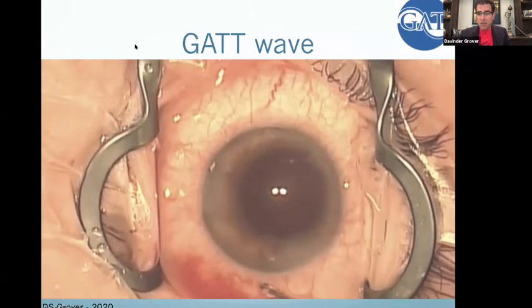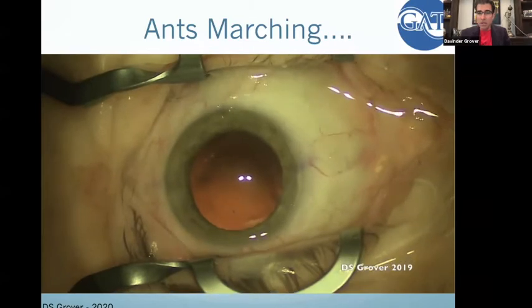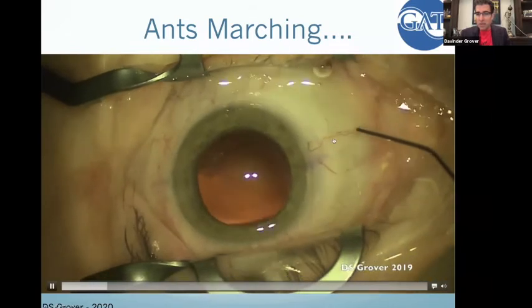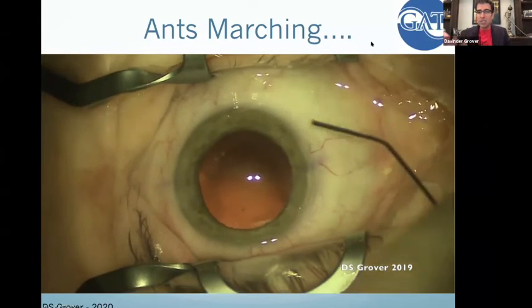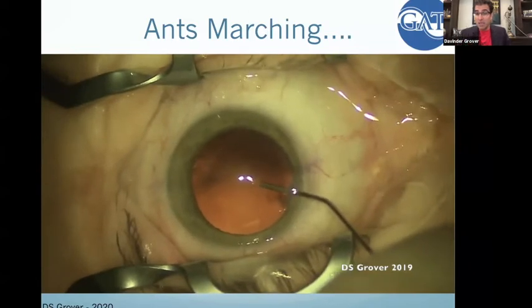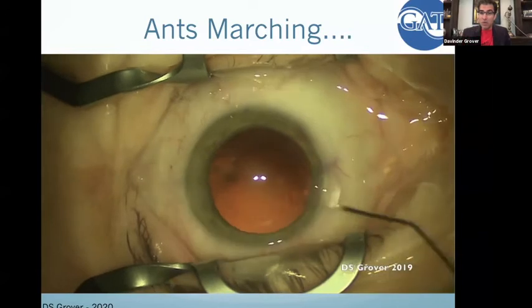And what we did was, and this is just another thing. This is after a dual blade, a hook dual blade goniotomy. You see, just as I'm just a phaco dual blade, look at the pattern. This is almost like ants marching. The patient's aphakic right now. I haven't even put in the lens. I'm just inflating it, but I'm inflating the eye, and that goes away, and I'm reversing flow.